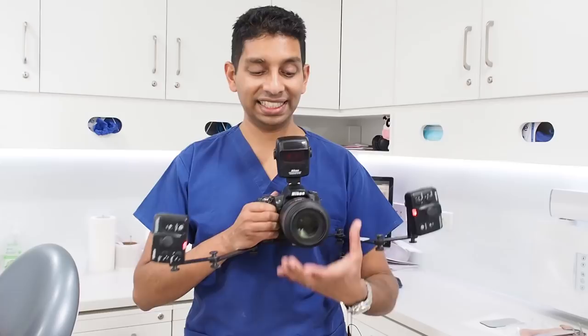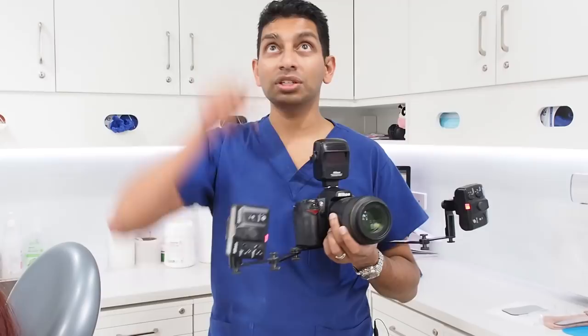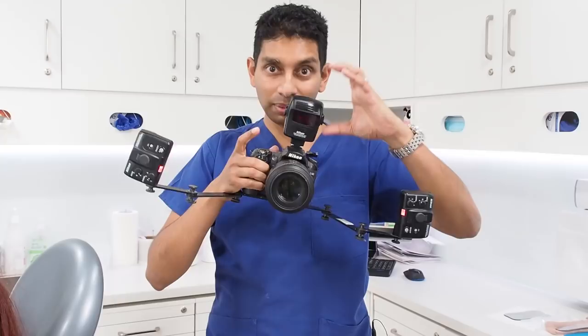To take extraoral photos, turn the flashes away from the subject so you bounce the light off the roof and the floor. We're also going to turn the f-stop number as low as possible — that means the iris opens up as big as it can. So Katie, just turn towards me: straight on, and big cheesy smile. Then turn towards that wall — this is for ortho profile photos — look straight ahead and big cheesy smile.